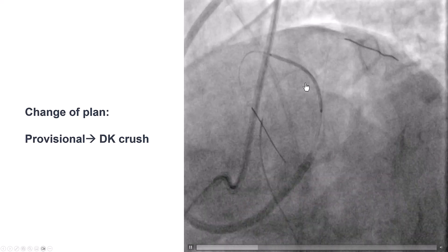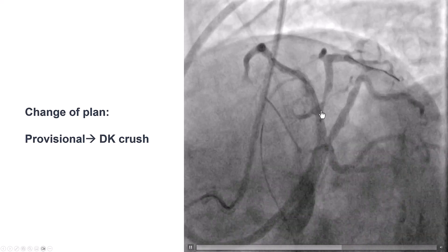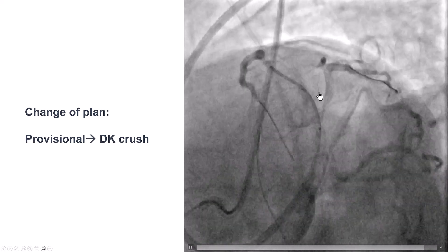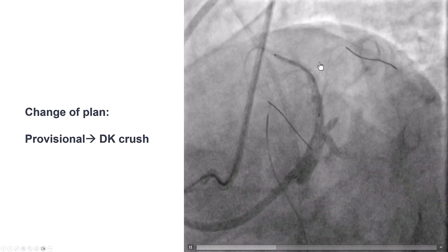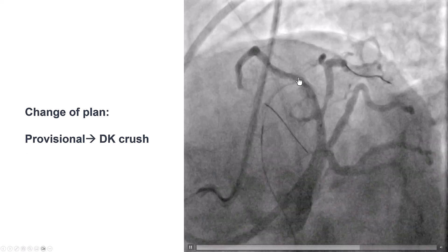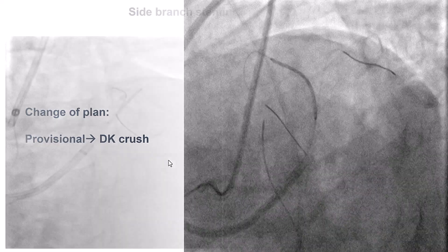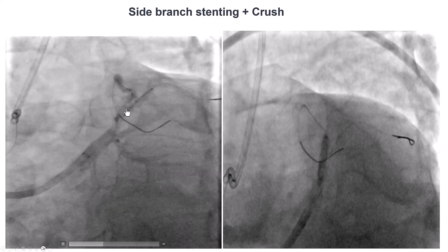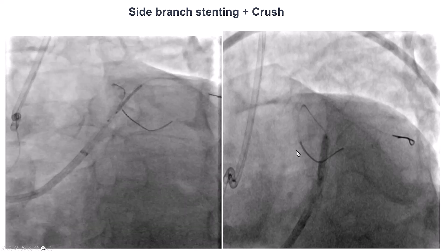Before deploying the stent, the retrograde gear needs to be removed. As we were ready to do that, we realized the lesion in the diagonal was actually more severe and longer than we thought, and it was a fairly large branch. So we decided to change our treatment strategy from provisional to a two-stent technique with a DK crush. We removed the retrograde gear, pre-dilated the side branch, advanced the side branch stent, deployed it, then it was crushed.